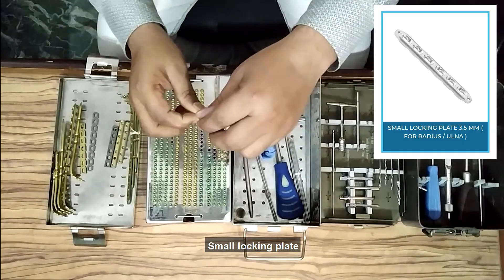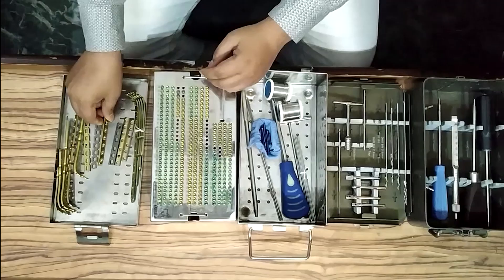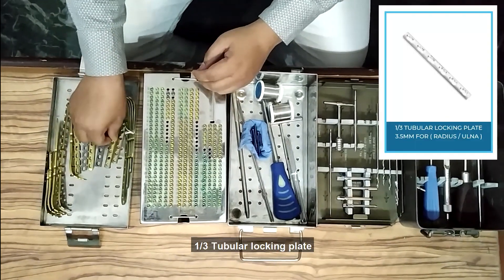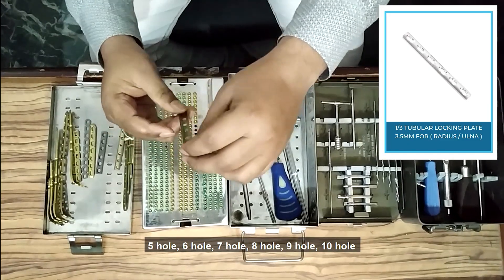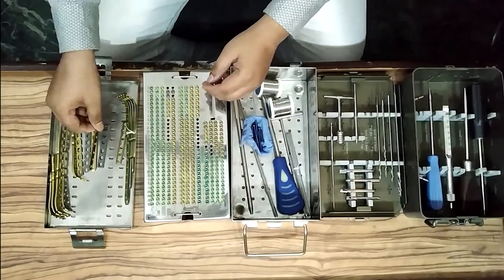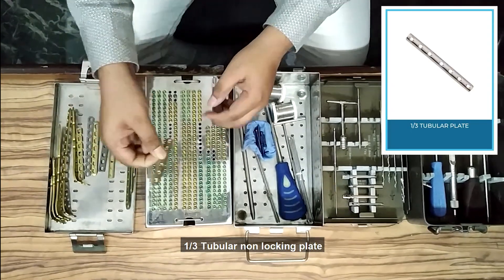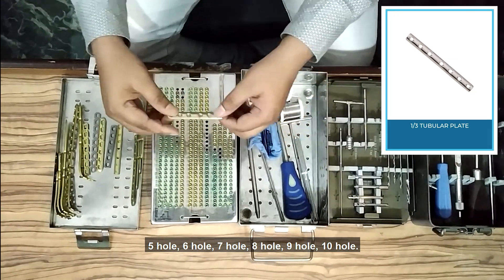Small locking plate: five-hole, six-hole, seven-hole, eight-hole, nine-hole, ten-hole. One-third tubular locking plate: five-hole, six-hole, seven-hole, eight-hole, nine-hole, ten-hole. One-third tubular non-locking plate: five-hole, six-hole, seven-hole, eight-hole, nine-hole, ten-hole.